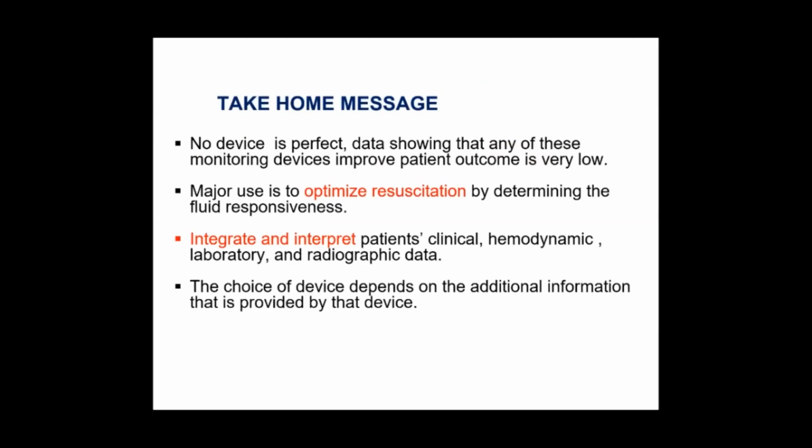So what's the take-home message? No device is perfect. Data showing that any of these monitoring devices improve patient outcome is very low. So the major use of these devices is to optimize the resuscitation by determining the fluid responsiveness, and to integrate and interpret the patient's clinical, hemodynamic, lab and radiographic data. The choice of device depends on the additional information which is provided by the device.